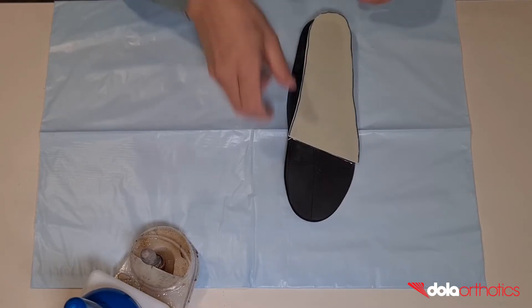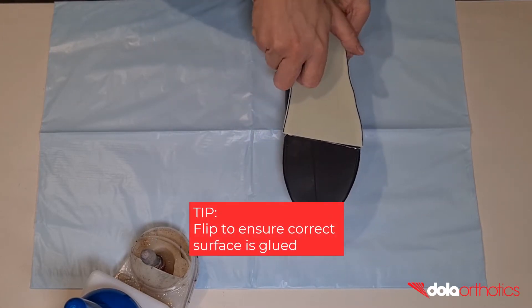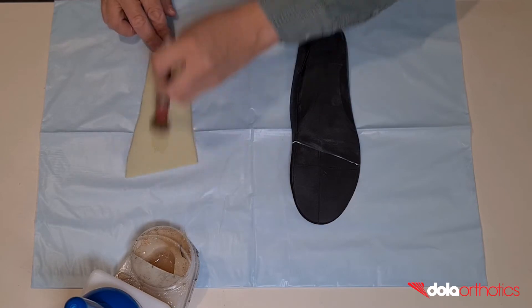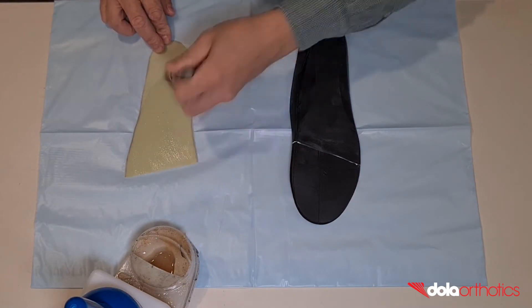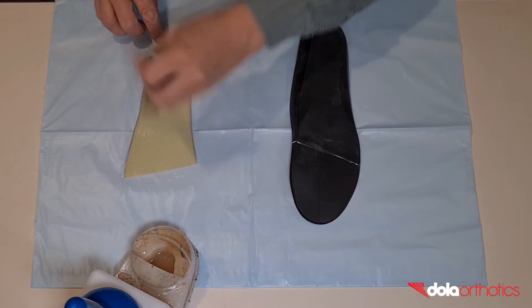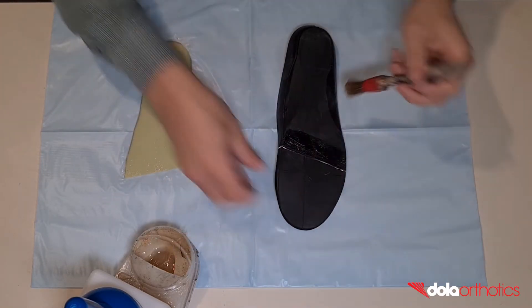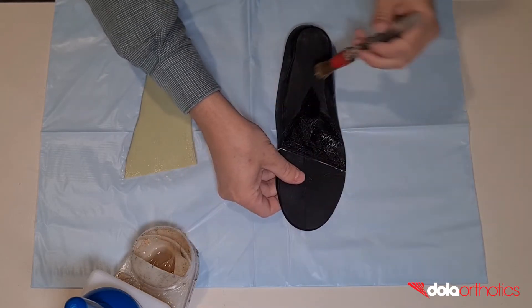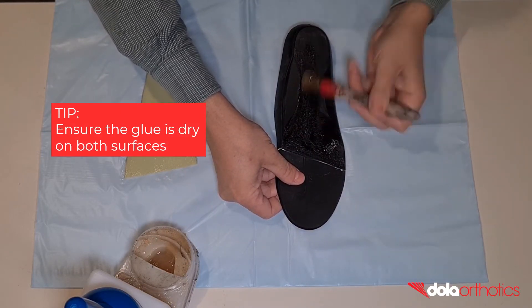To ensure you are gluing the correct surface of the Dola Tech sheet, place the sheet on the orthotic and flip to expose the dorsal surface. Place a thin layer of glue on the dorsal surface and the plantar surface of the orthotic in the roughened area, between the anterior guideline and the heel. Wait for both surfaces to be touch dry without any areas of wet glue before proceeding.